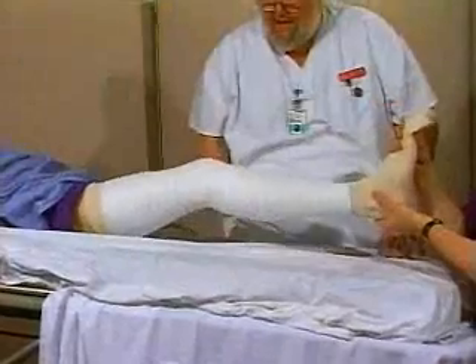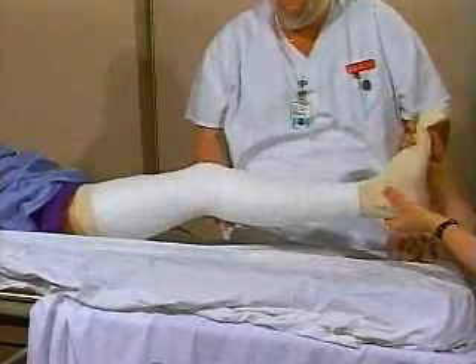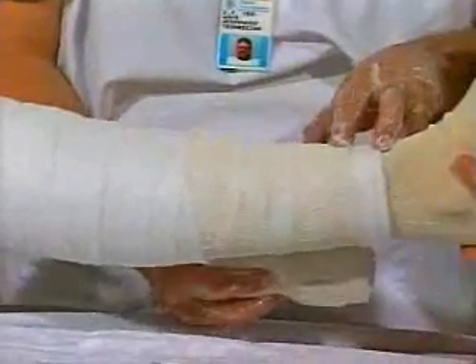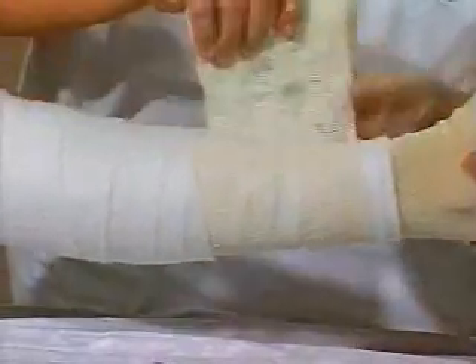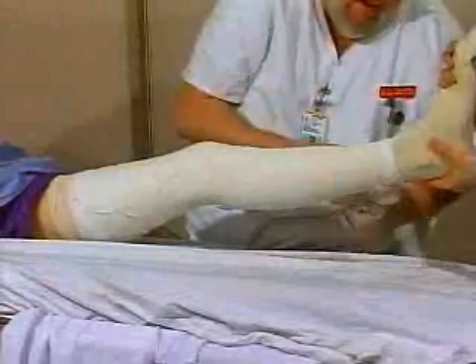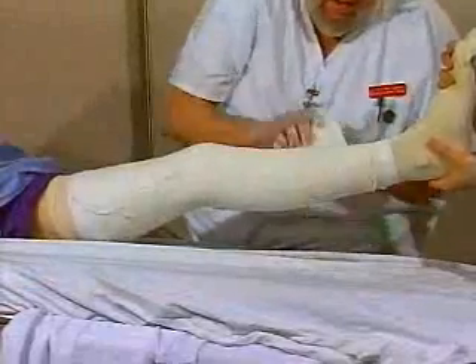The knee should be at 5 degrees of flexion. Start the plaster distally about 2 centimeters above the end of the cast padding. Extend it proximally, making tucks and folds with extra material when needed. Apply a second layer identical to the first. Fold down the cast padding.